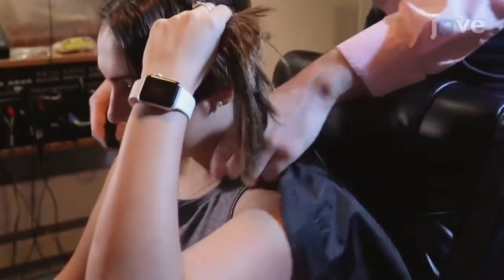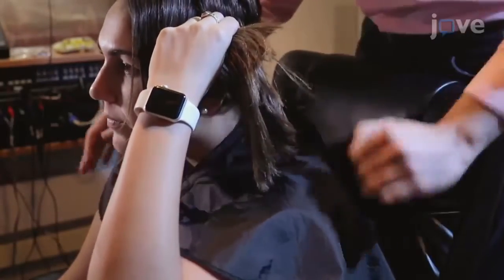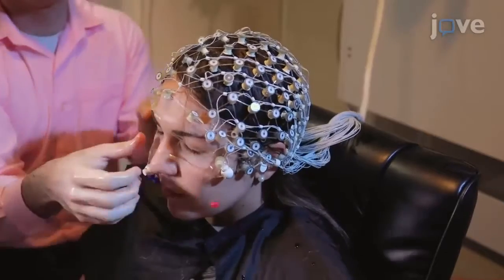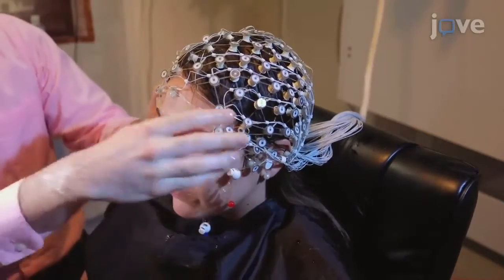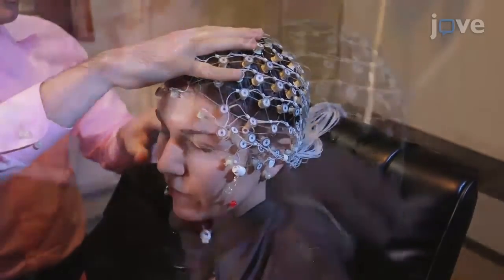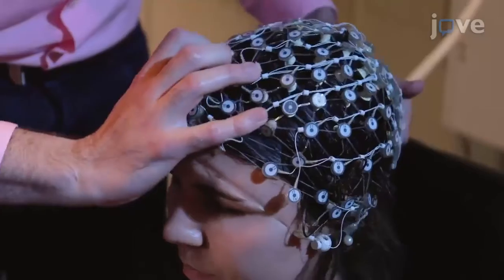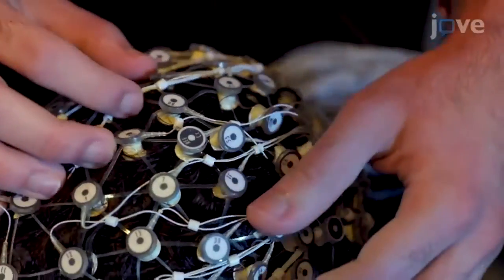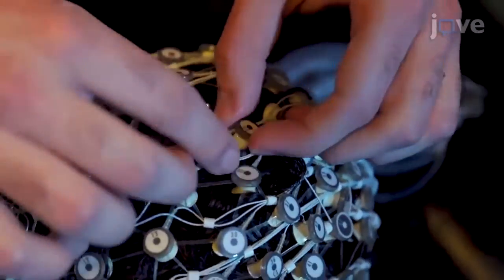Place a towel or other absorbent material around the participant's neck to prevent the solution from dripping onto his or her clothes, and instruct the participant to close his or her eyes. Then firmly grip the EEG net with both hands and place it onto the participant's head. Ensure that the net is placed symmetrically on the scalp with the reference electrode at the scalp midline point that was measured.